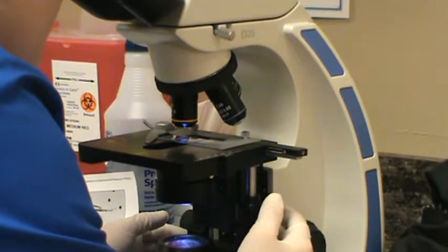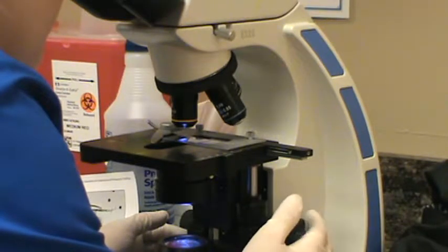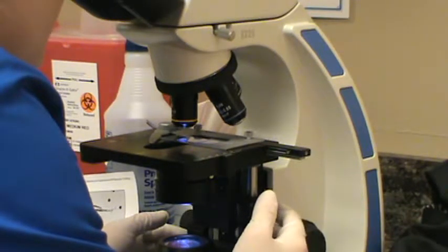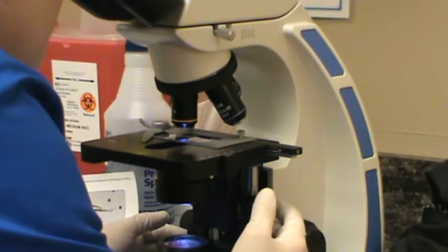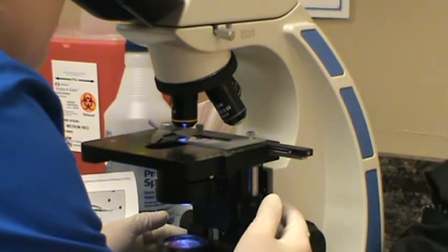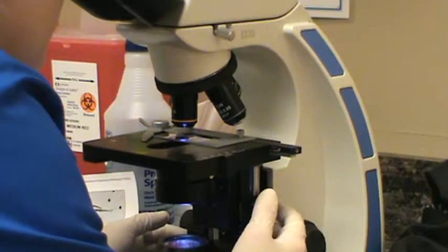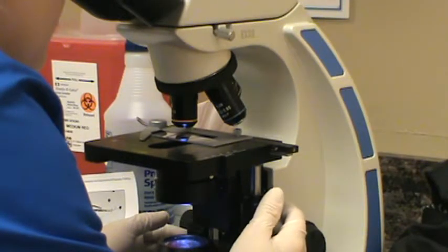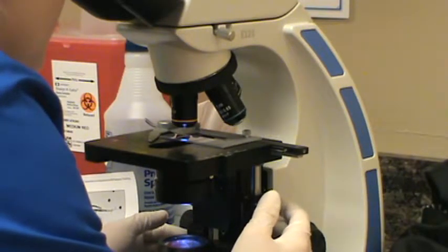Here in Oregon where I live, we don't have a lot of heartworm-positive canines, and heartworm-positive felines are extremely rare — maybe one in a million. Those of you in the south will see a lot more. We've only ever had one heartworm-positive dog here. Finishing up the scan, I am not seeing any microfilaria, which is good. I'm going to call this microfilaria negative.